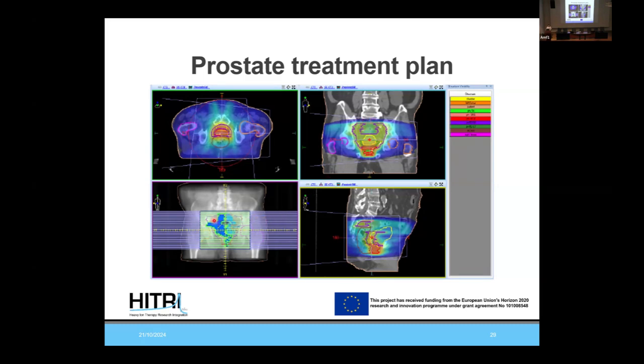So, yeah, he's using the segments. He's trying to irradiate the PTV, the target, but with VMAT, as we are going to see here, it's a full arc. So there are so many entrances of the beam. So the result is to irradiate so many other organs, but at very low dose. With protons, we do not have that problem. It's only two beams, as I have seen. Better results with protons.